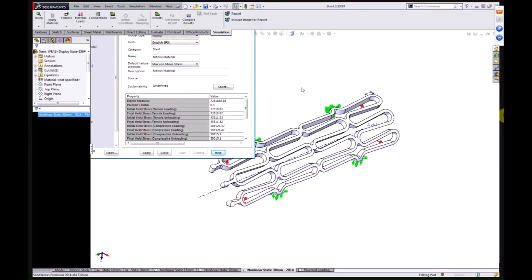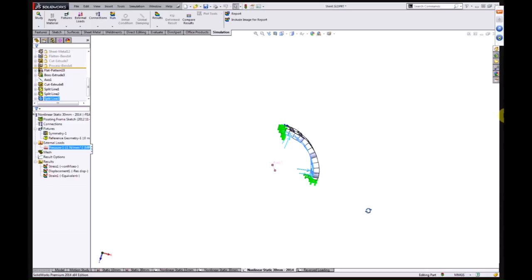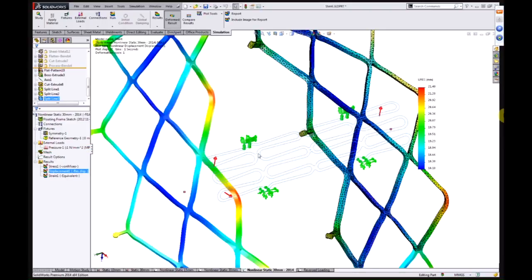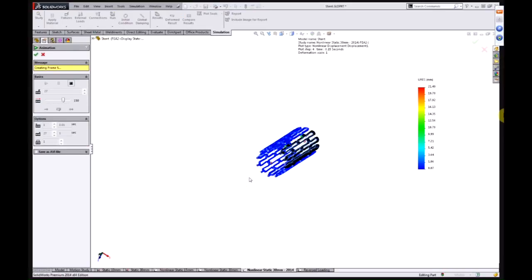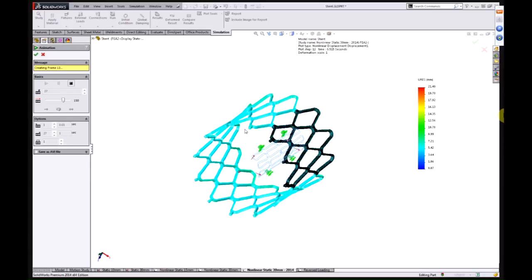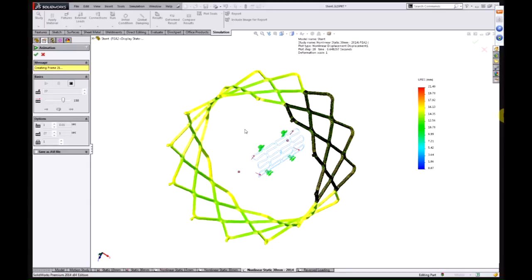You're looking at the effective shape change under a small pressure load, and even though I've modeled a quarter of it, I can replicate the result to show the full round. We can see we can achieve some pretty extreme deformation. It's pretty impressive how much of a shape change SOLIDWORKS Simulation can account for here, and we can look at stress levels that are developed through here.